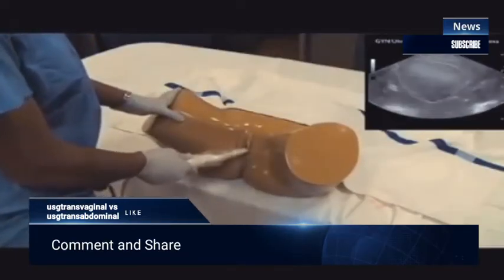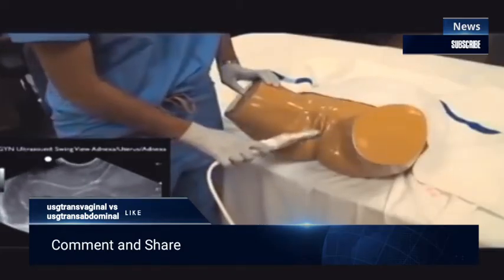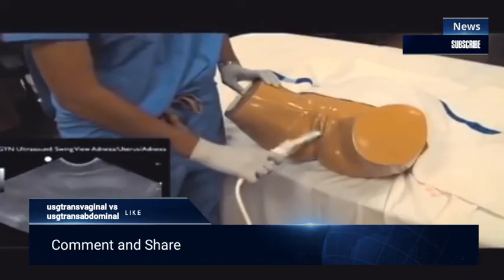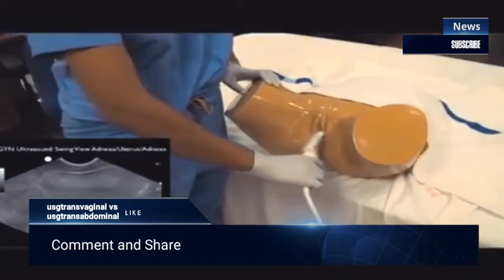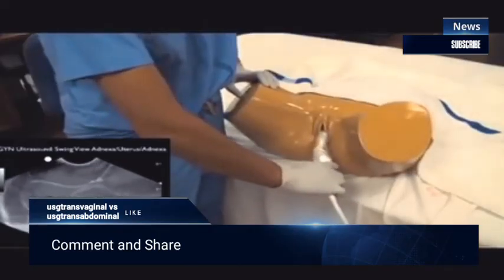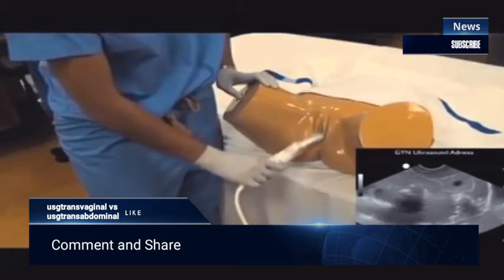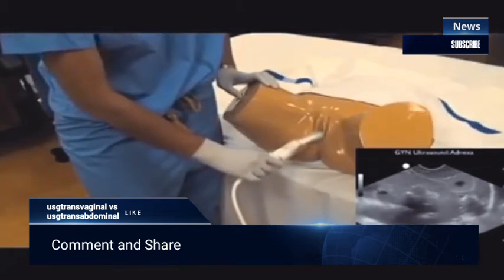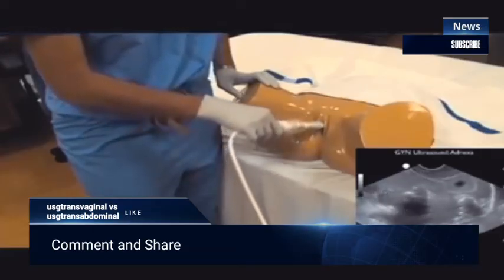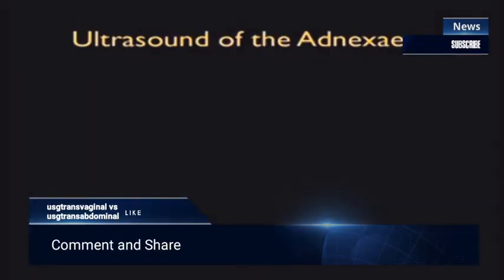So that's going to be called the flip technique, where we're flipping the probe 180 in between the two adnexal structures. The other technique is known as the swing technique. Here we're keeping the probe marker always over towards the right and just swinging the probe from first the left adnexa to now over towards the right adnexa as shown here. This just emphasizes the fact that we may need to move the probe up or down in a vertical axis to best visualize the ovary, as the ovary could be in an anterior or posterior relation to the uterus.